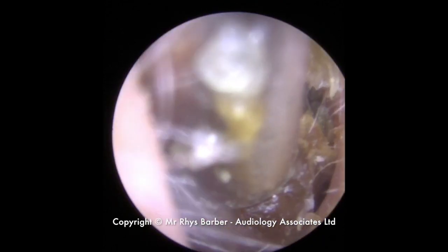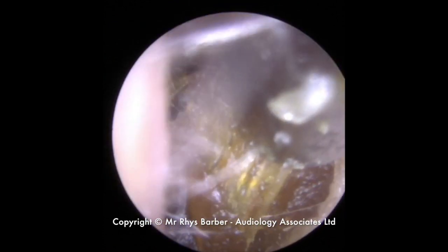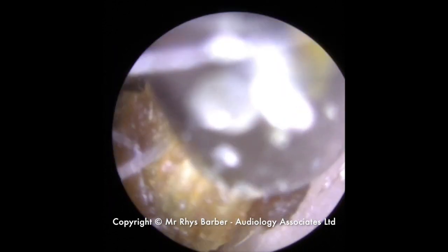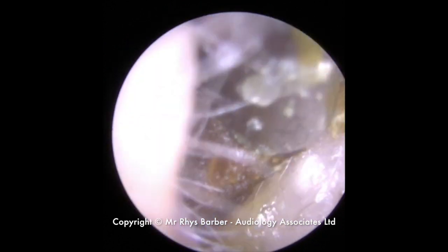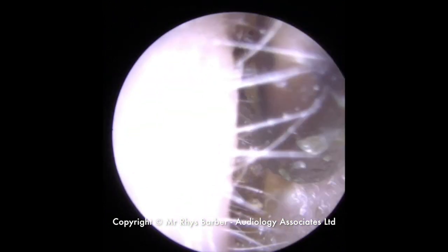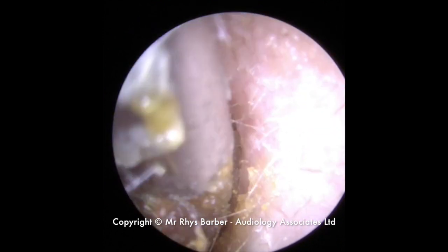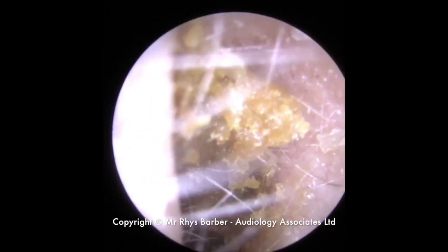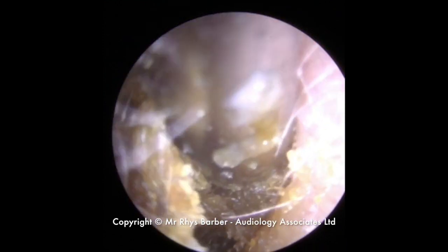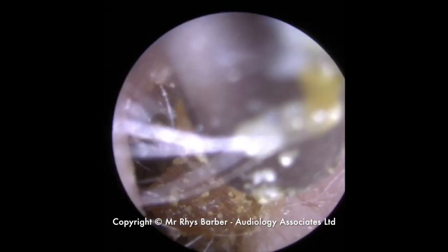Getting a better grip on it now, really starting to get a much stronger suction grip on this skin. Still trying to maneuver it out. You've seen me use that wiggling technique on the wax, but it does help sometimes to get most things out of the ear canal — skin, debris, wax and things like that. Just that rocking motion back and forth, trying to loosen it as we're pulling it out. You can see at the moment it's just breaking away in small bits. Most of this is getting sucked straight into the machine — this will end up in the tank at the front of our suction machine.